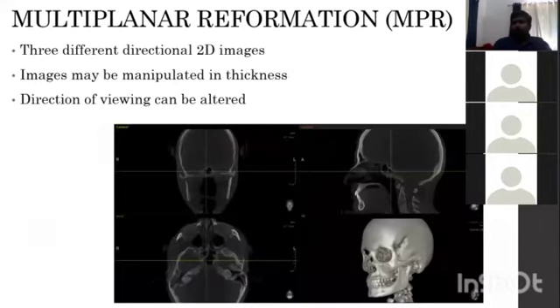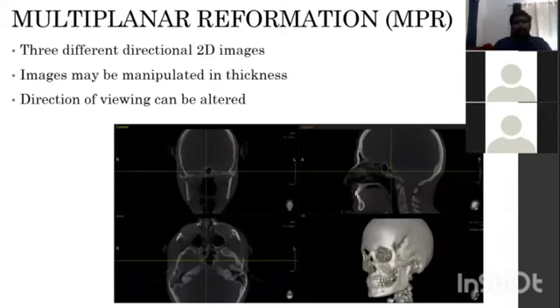And as I already told, we will provide a CD to the patient with the images in DICOM format, and we also include a viewer in that. If you put it in a laptop or a computer, you will have a screen like this with some tools. And this is called the multiplanar reformation. You will get three 2D images with a 3D image. The 2D images are axial, coronal, and sagittal views, along with the 3D reformed structure.